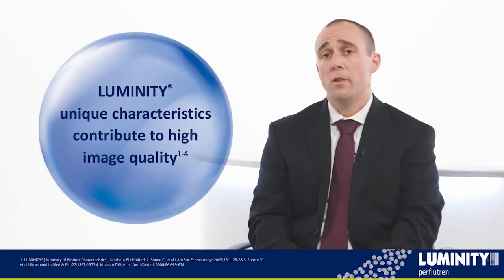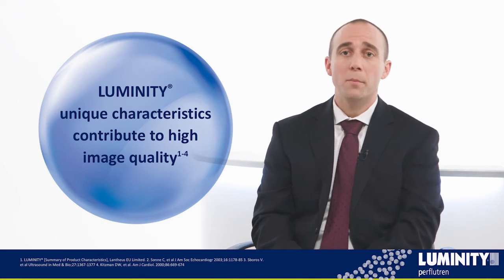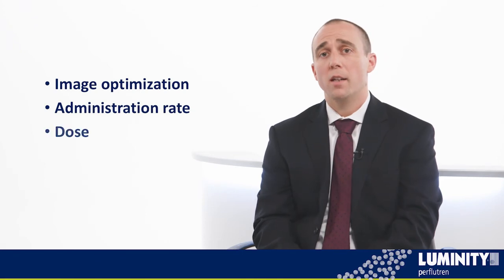So we reviewed the unique characteristics of Luminity and how it produces high image quality. We discussed the importance of looking at the indication before doing an echo. We also discussed the importance of knowing why you're using Luminity on a particular patient to know exactly what the question is you need to answer. We touched on some techniques of image optimization, also administration rate and dose.